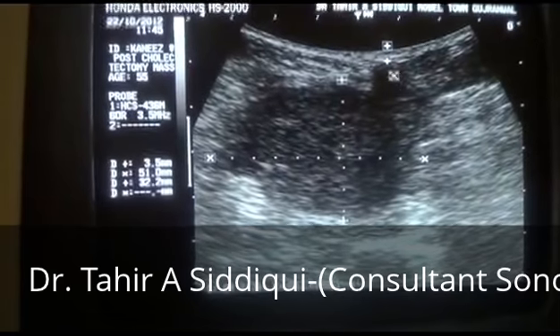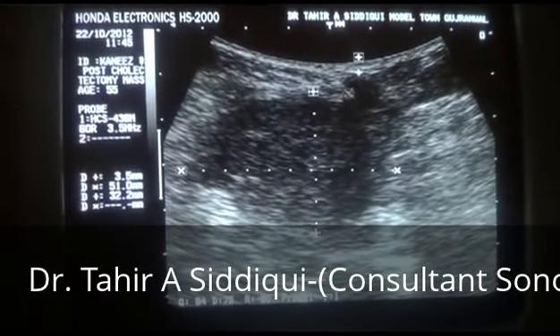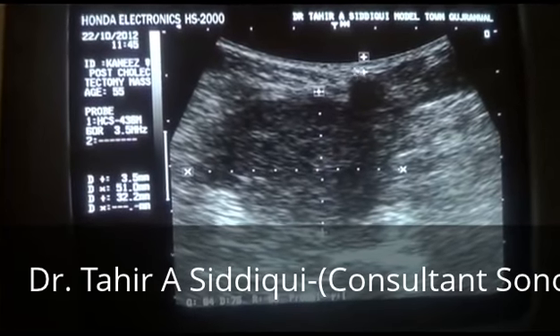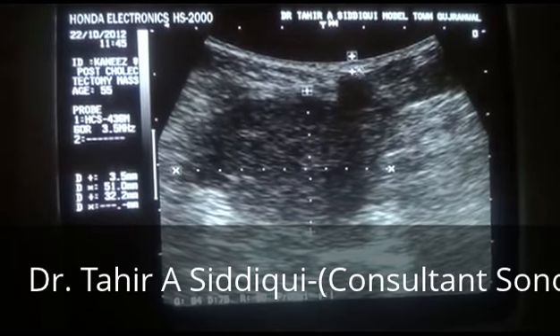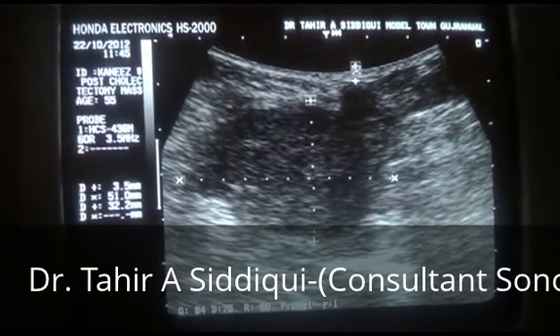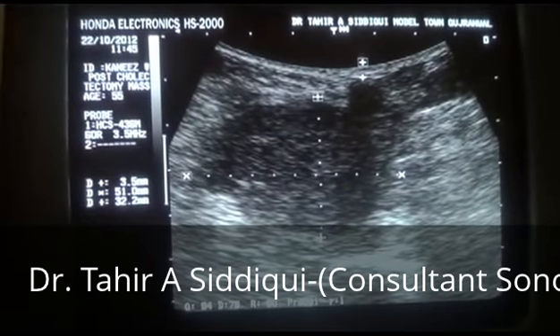You can see that this mass extends anteriorly up to the skin, just 3.5 millimeters below the skin.